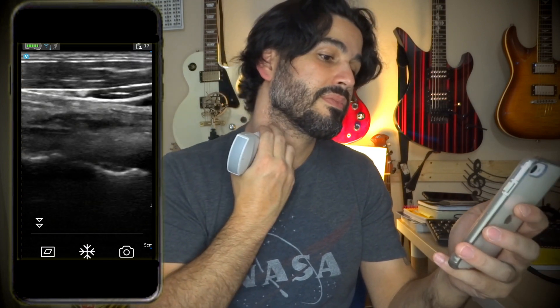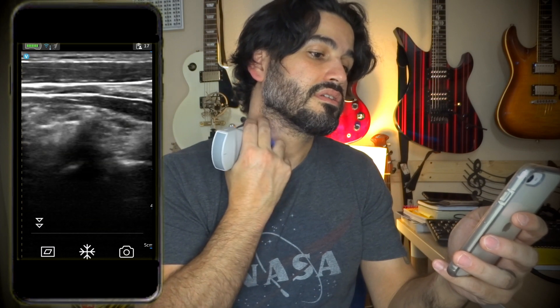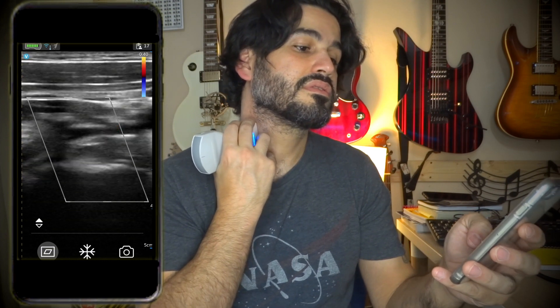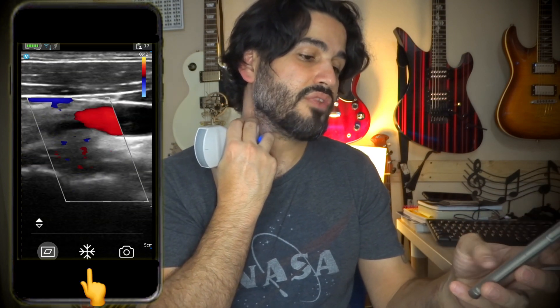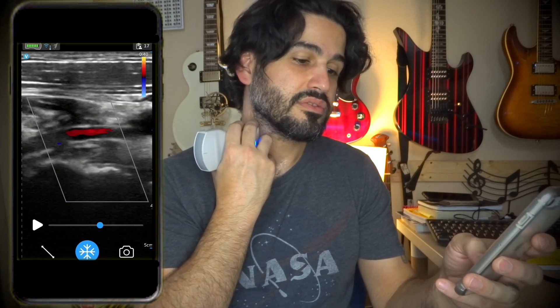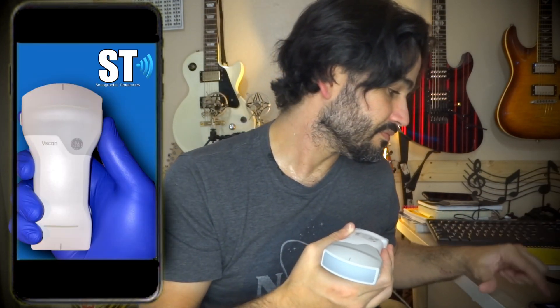Let's see if I can see the vertebra. Carotid there, angle laterally — there it is. You can see the vertebral artery; let's put color Doppler on it. This little snowflake button is the freeze button, and once you freeze you can scroll to find a picture you like, then press the camera button to take a picture. I'm going to be doing several protocol videos and sharing on Instagram as well — stay tuned, thank you, bye.